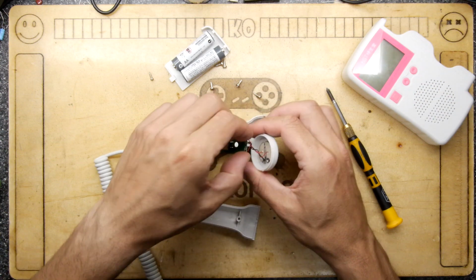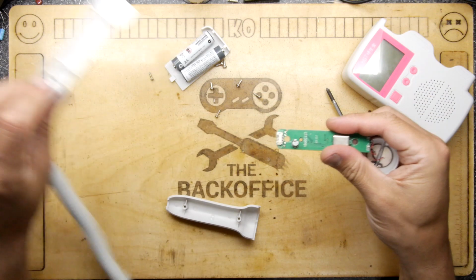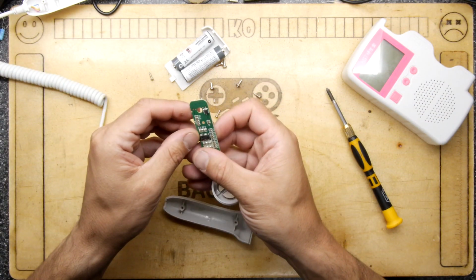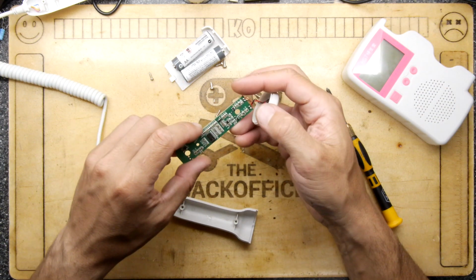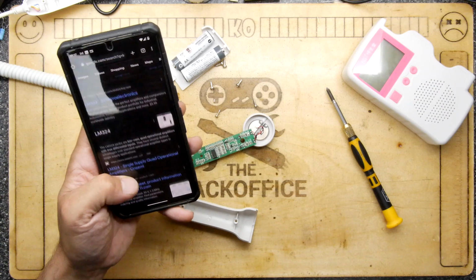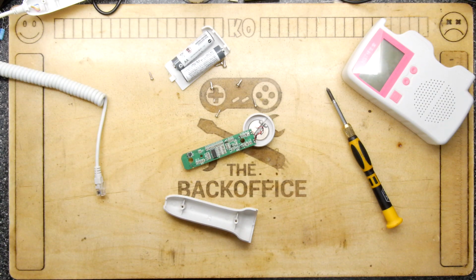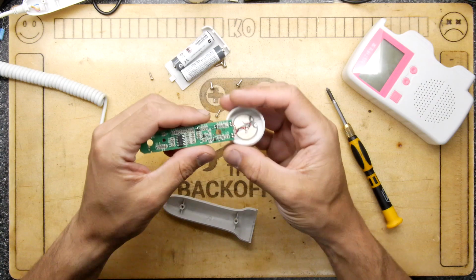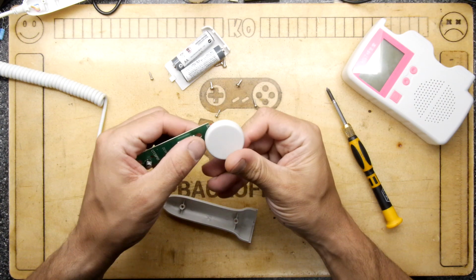It's on a nice little PCB that is removable, so we can just pop it out. And again, another LM324 on here, so we really must look up an LM324. And there you go, it's a quad op amp with true differential inputs apparently. So it's an amplifier. So this thing's got at least 3 of these in here. They're amplifying obviously the very tiniest signals that these things will be generating.